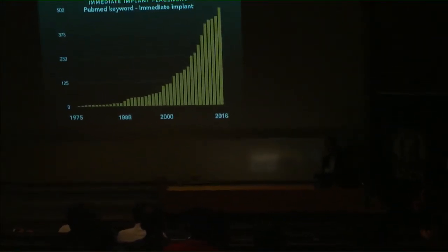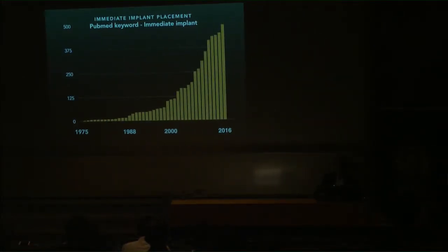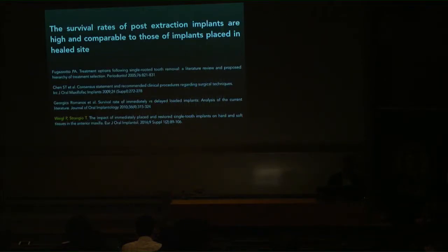Where does immediate implant stand in contemporary implantology? A PubMed search on immediate implants has shown a steady increase in the number of studies during the last 15 years, from 100 articles in 2000 to 500 articles in 2016. There is definitely a growing interest in this subject. Recent systematic reviews have confirmed that immediate implants can be a predictable option in implant therapy. The advantages include faster treatment time, less extensive surgical procedures, lowered cost, and less patient suffering. Properly done, the natural hard and soft tissue can be faithfully preserved.